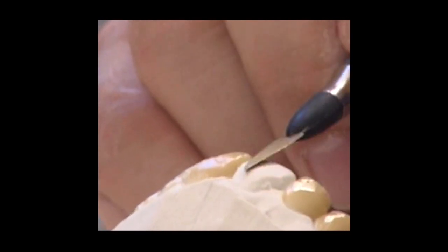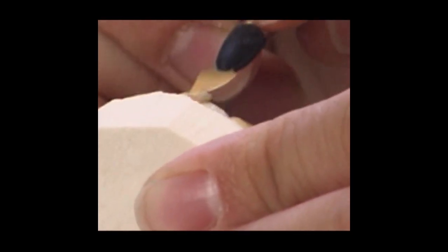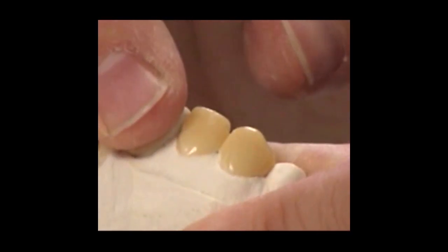So now I'm down to 1. I'm going to put more of the composite on top of number 8 to complete the composite mock-up. Simply, as you all know, do it indirect. We put them on nicely smooth, heat it up a little bit. Place the indirect composite on all teeth involved. Making it a little bit wider and bigger gives you a chance to adjust in the patient's mouth after the temporary is in the patient's mouth.